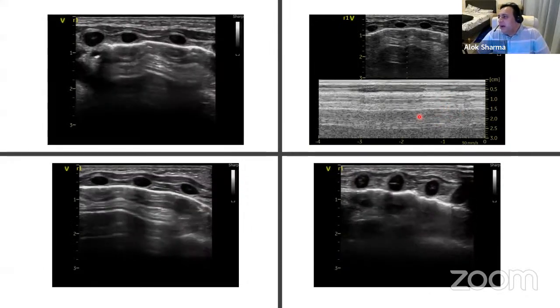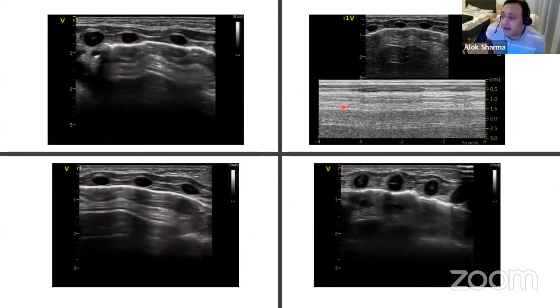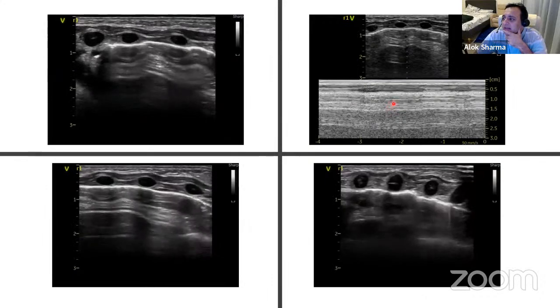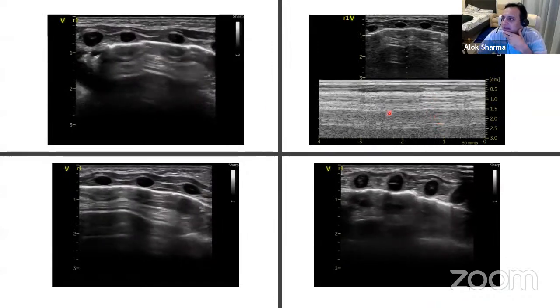Okay, so we got a little bit of confusion there. What I'd say to you is that unfortunately I haven't been able to save the moving image of this, but there is a seashore with a barcode coming in, and when we see the next few cases, we'll be able to delineate that.